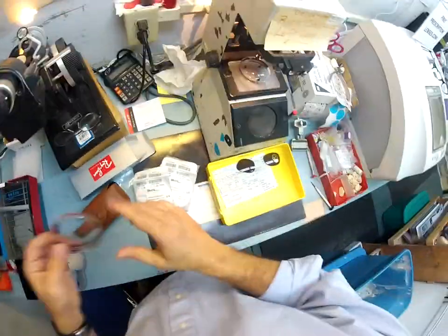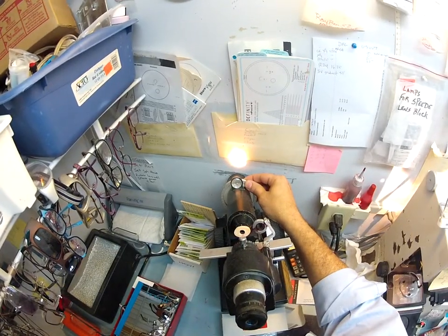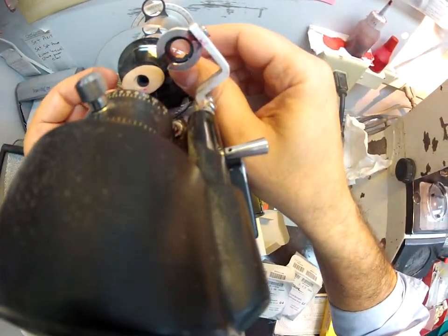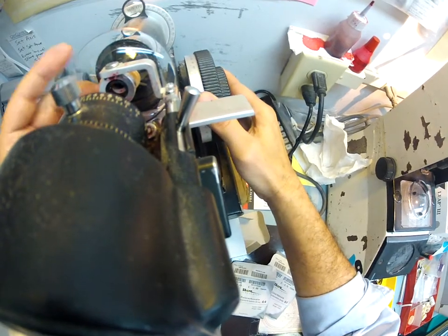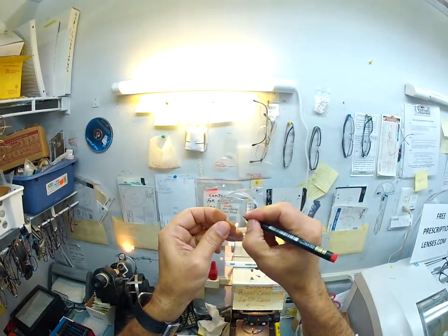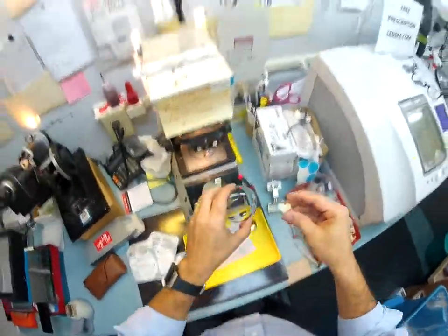Now your left lens — spin the axis wheel to 168, because your prescription is minus four and a quarter, minus one at 168. Spin the power drum to four and a quarter. I got lucky — I didn't even have to rotate the lens. Check your cross curve, your astigmatism correction — that's good. I'm dotting up the optical center of the lens; this red dot is gonna sit directly in front of your pupil.